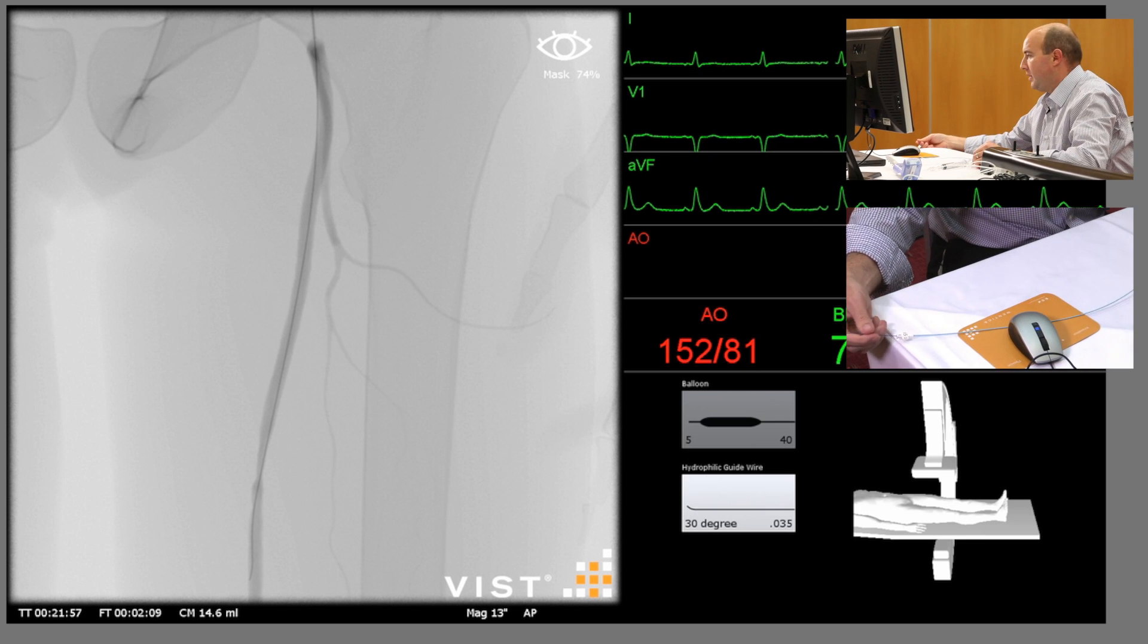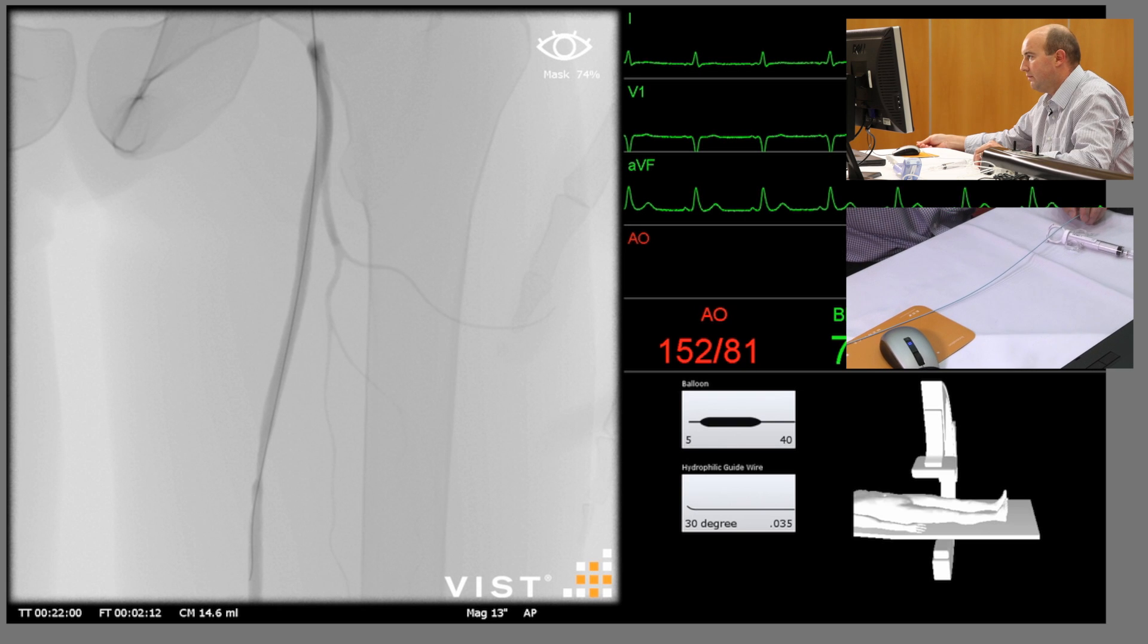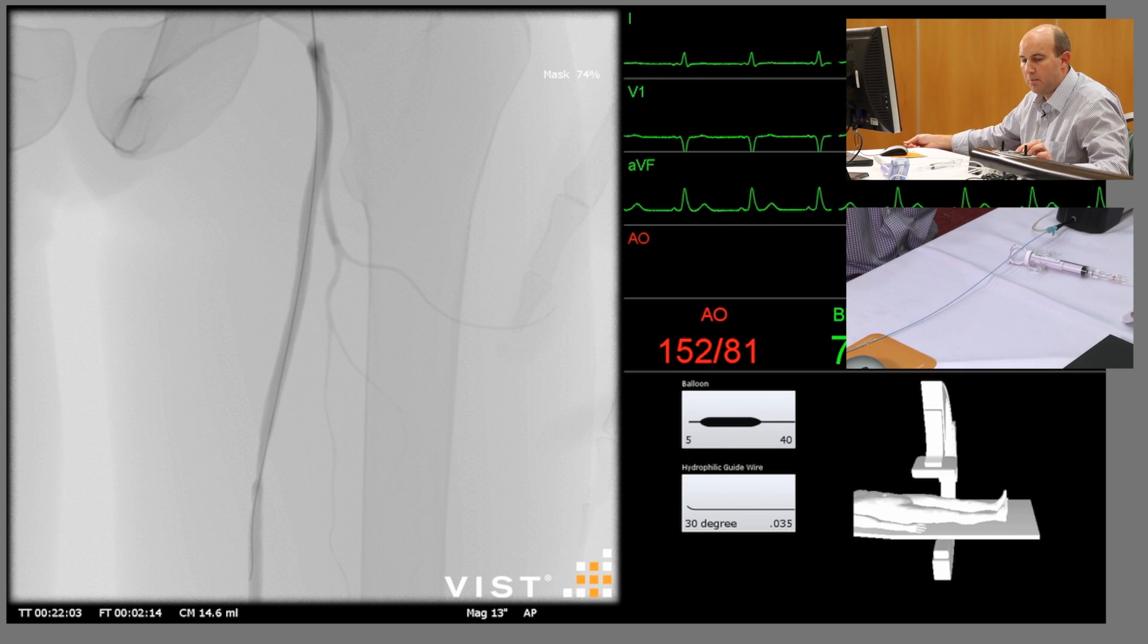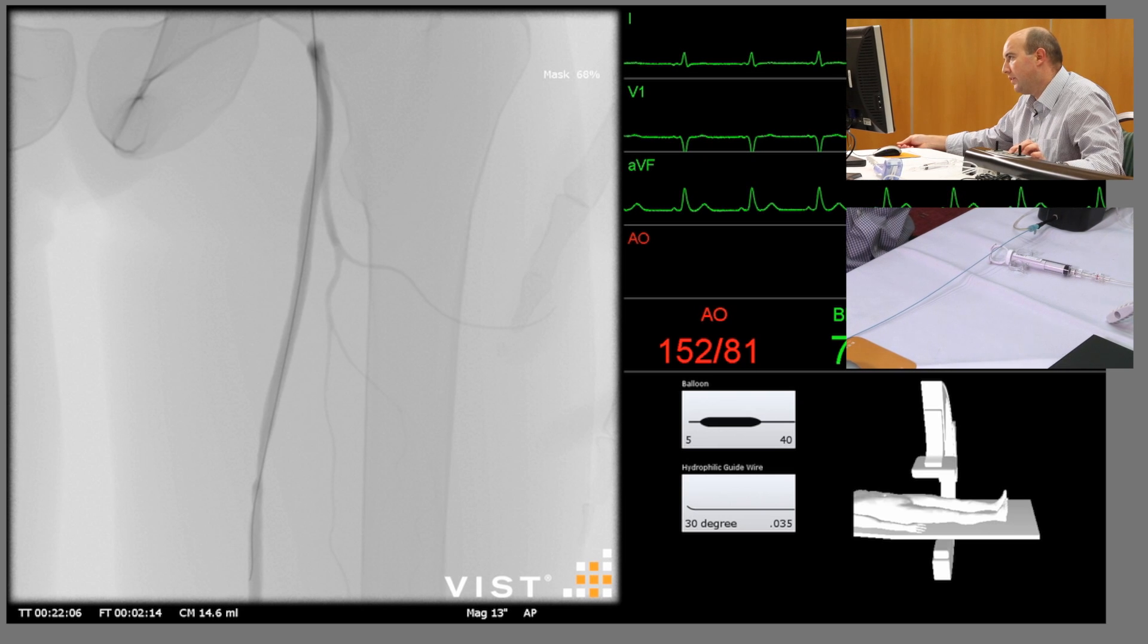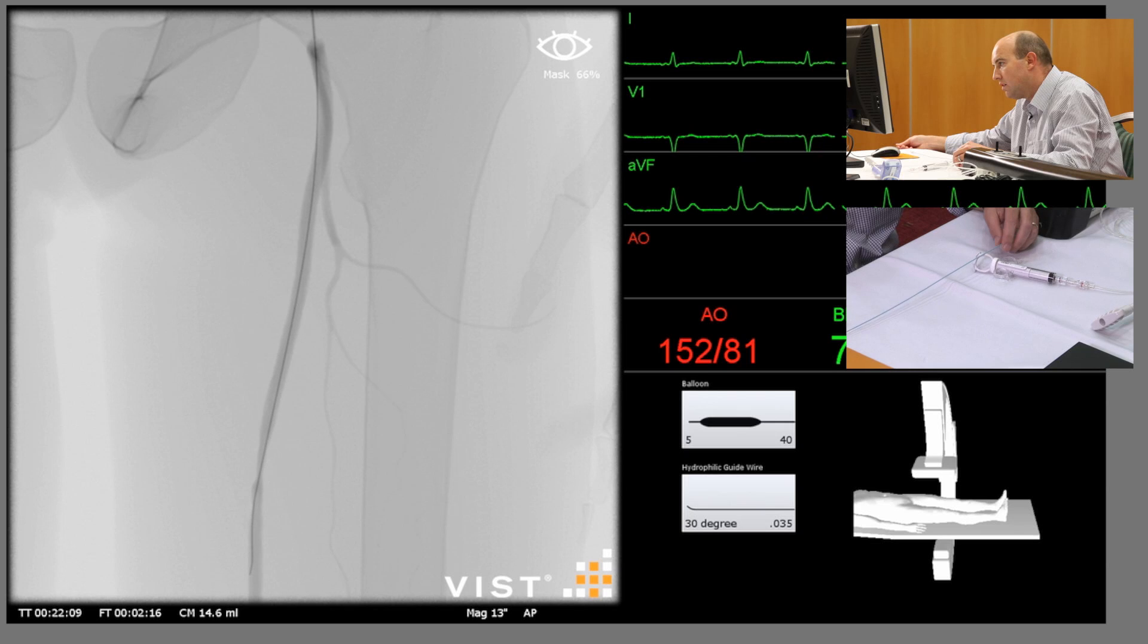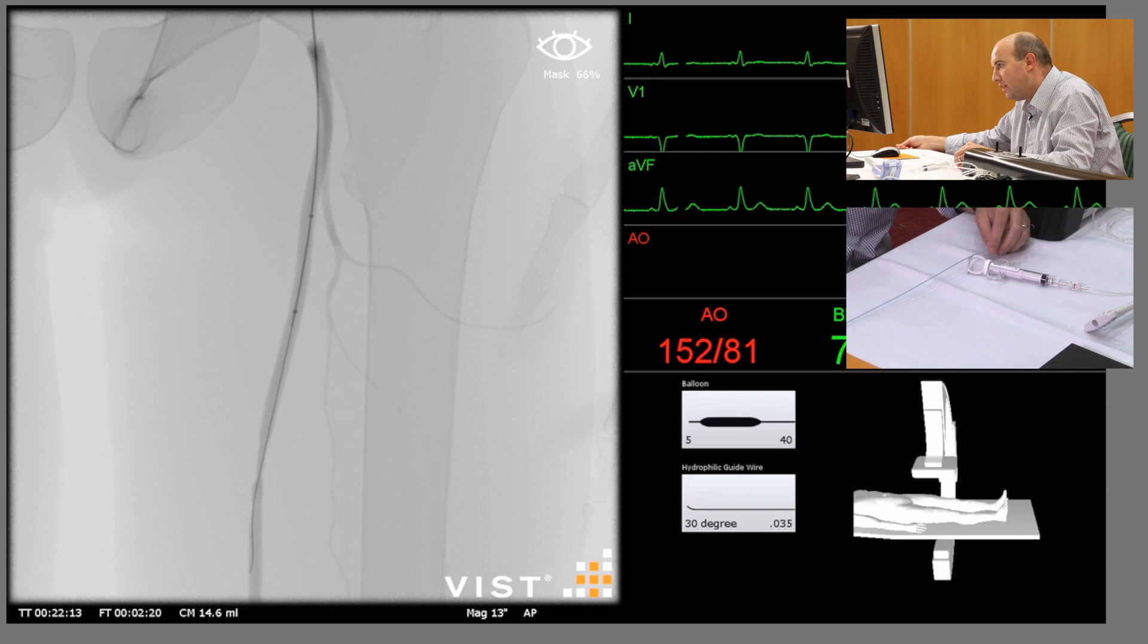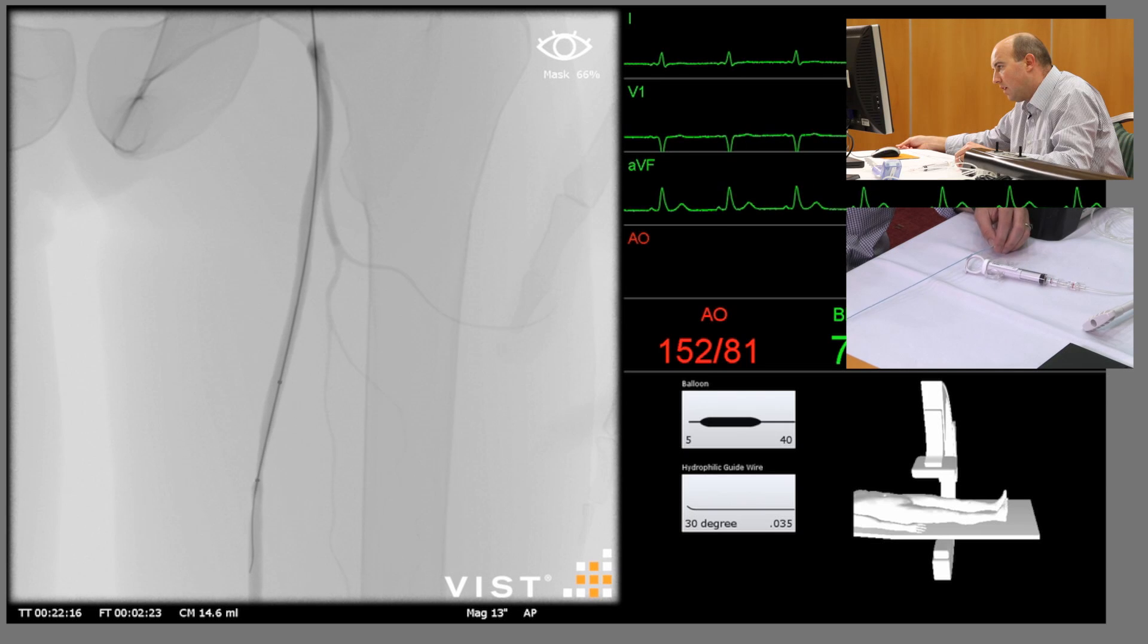Still hasn't recognized the balloon. There it has now. Just take the mask a little bit off so we can see the balloon coming down. And there you see, just engaging down the SFA and position.